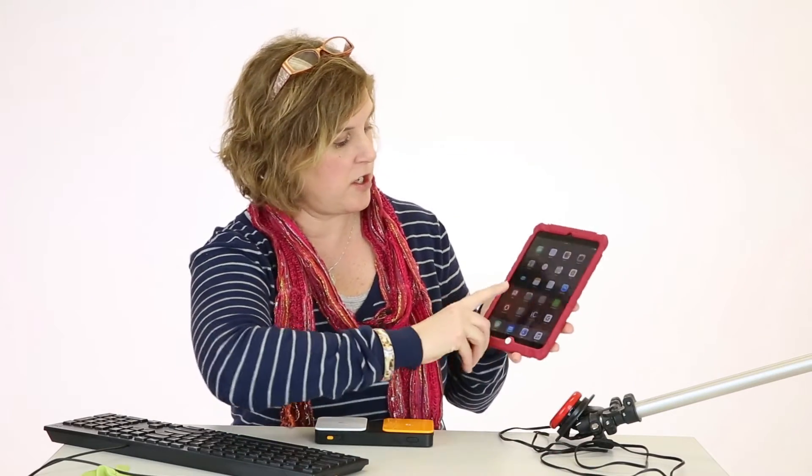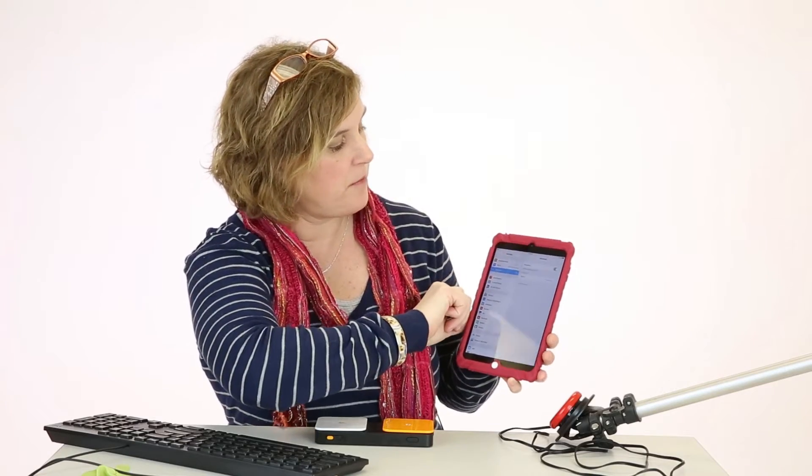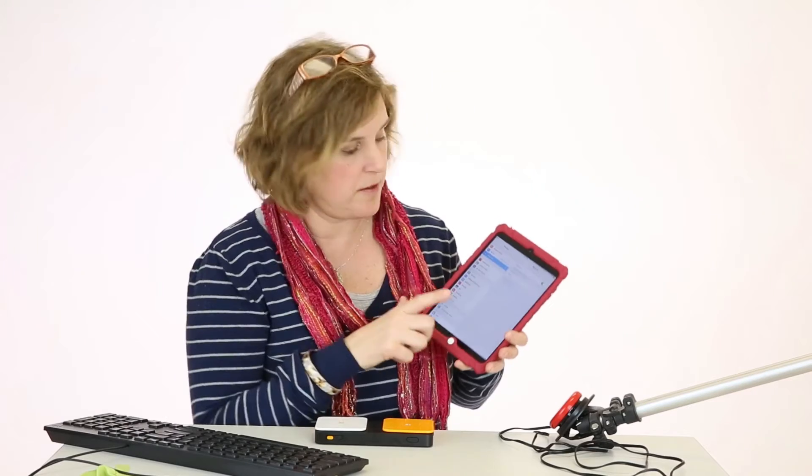What we're going to do first is pair the device using Bluetooth technology. You want to go to your settings and click Bluetooth. There we see the name of the switch — Bluetooth — and you can see it; it'll tell you if it's connected or not. You can go ahead and click on it to make sure. That's paired and that's pretty easy.